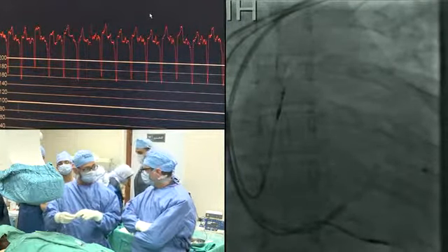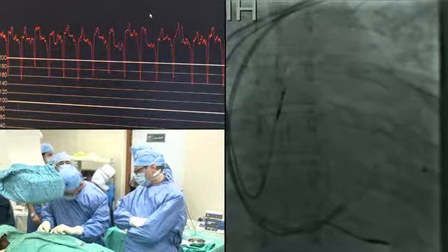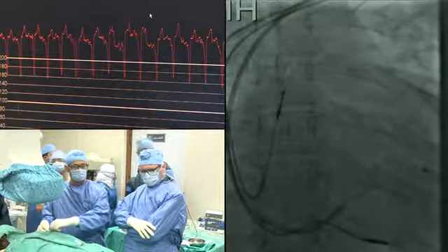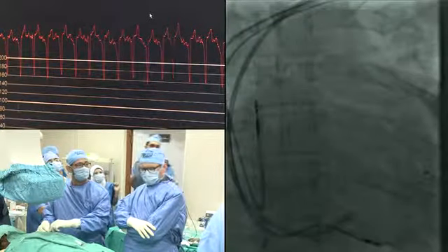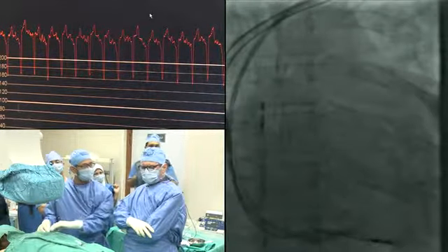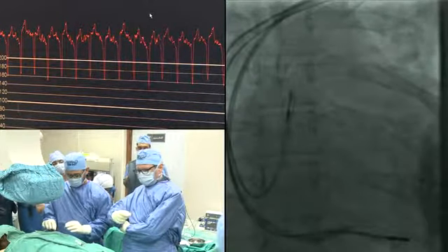For fixation, to reposition? No, I will not reposition. I will not fix on the J because it makes the extra loop. When I retract the J, I find an extra loop because it was stored in the J. No, I would have just pulled it back.